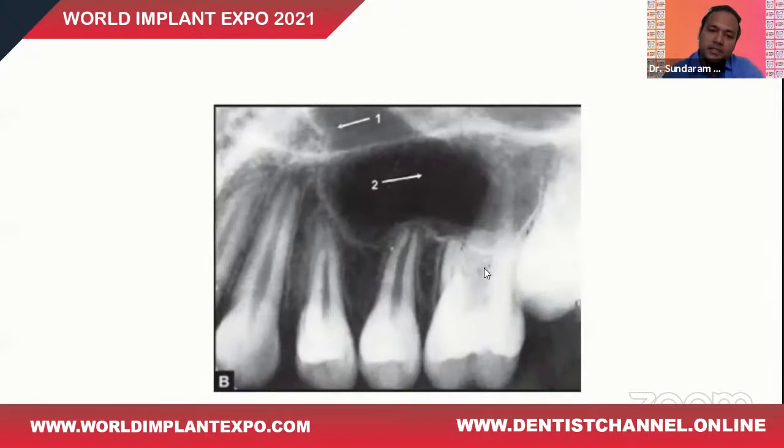This is an interesting radiograph where you could see 2 cavities, one over here and one over here. Number 2 undoubtedly is the maxillary sinus, because it is consistently associated with the maxillary premolars and molars. So this would be the sinus cavity. And what would be 1? The 1 is nothing but the nasal cavity. So this would be the border of the nasal cavity, and this would be the nasal cavity, which is superimposed onto the maxillary sinus.